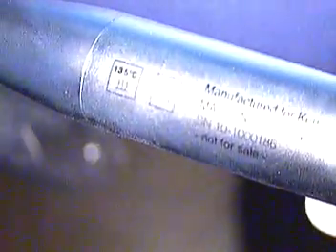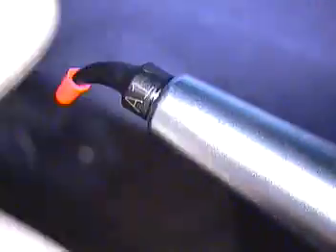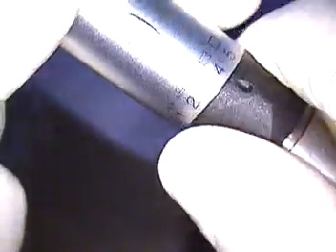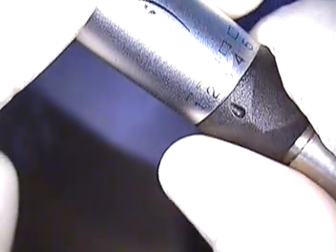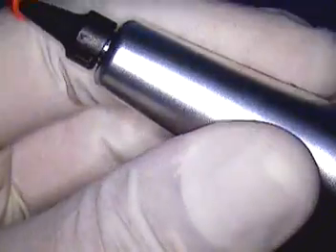That's the bag — I kept this bag around the microscope. You autoclave this and treat it just like a handpiece. This is the tip that contains the material; A1 we're going to use today. You can adjust the speed. We were on 5, but our last case it went a little too fast. We're going to be right around 2 or 3 — I'll try it on 2 first. Amazing results — about 1.3 shrinkage on this, so it's competing with everything out there.